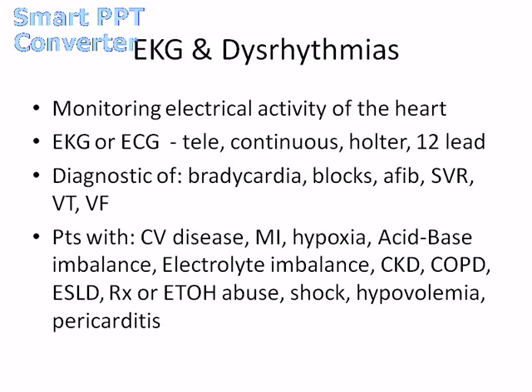Hey, I want to review electrocardiography and dysrhythmia monitoring right now. Cardiac electrical activity is monitored using an EKG or an ECG, either one interchangeable. The heart's electrical activity can be monitored with a 12 lead. We can use an ambulatory monitor known as the Holter monitor, or continuous cardiac monitoring, or telemetry, which is what we're used to seeing in the hospital.